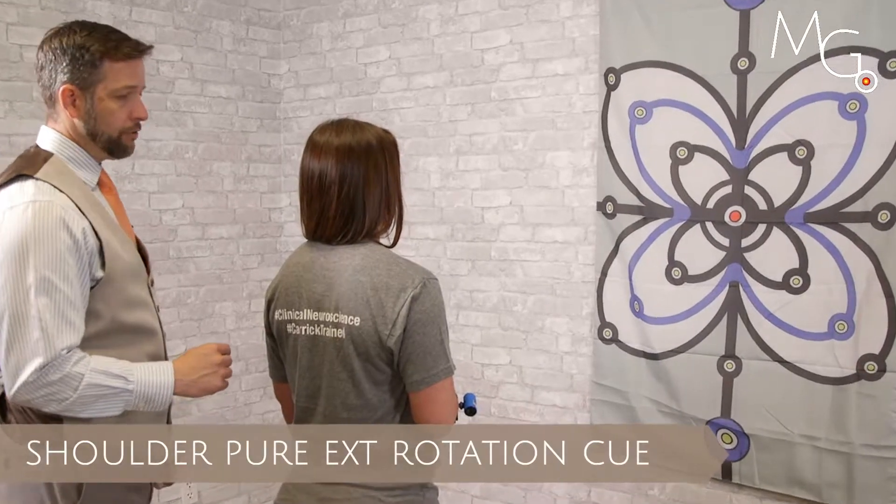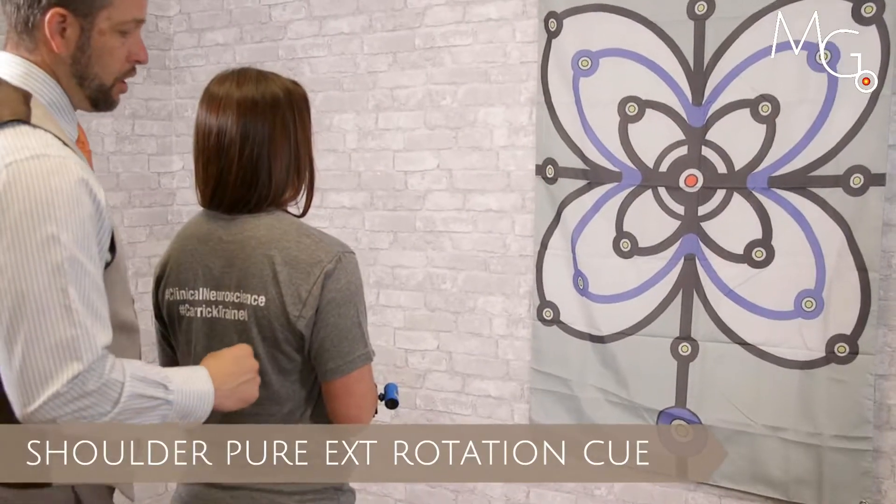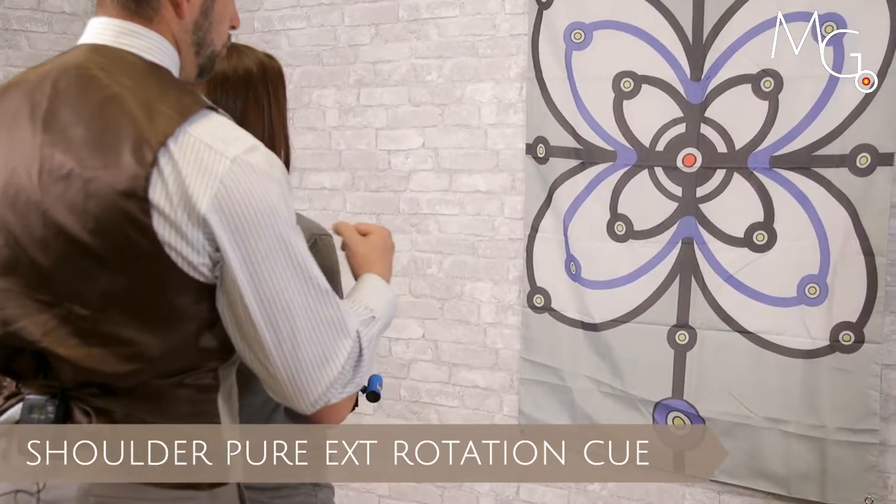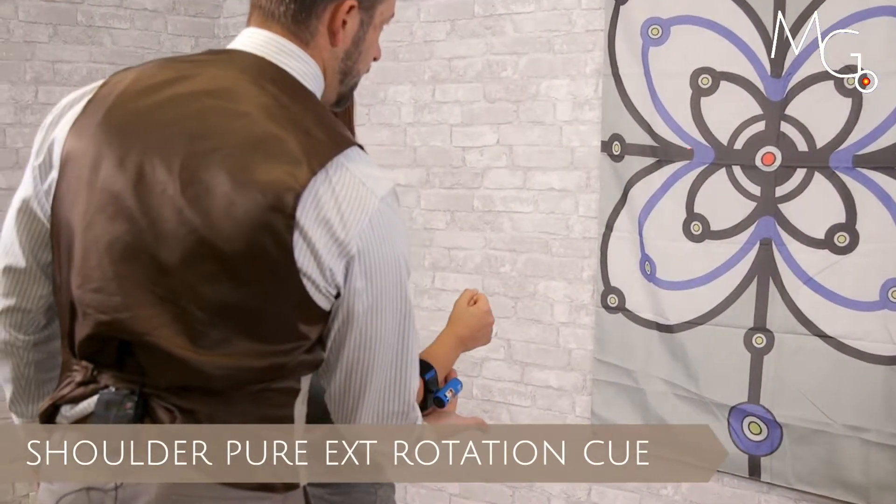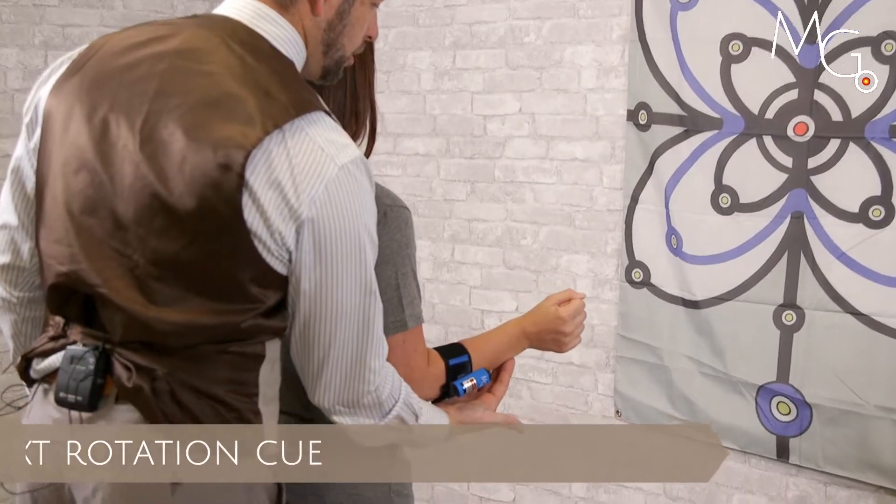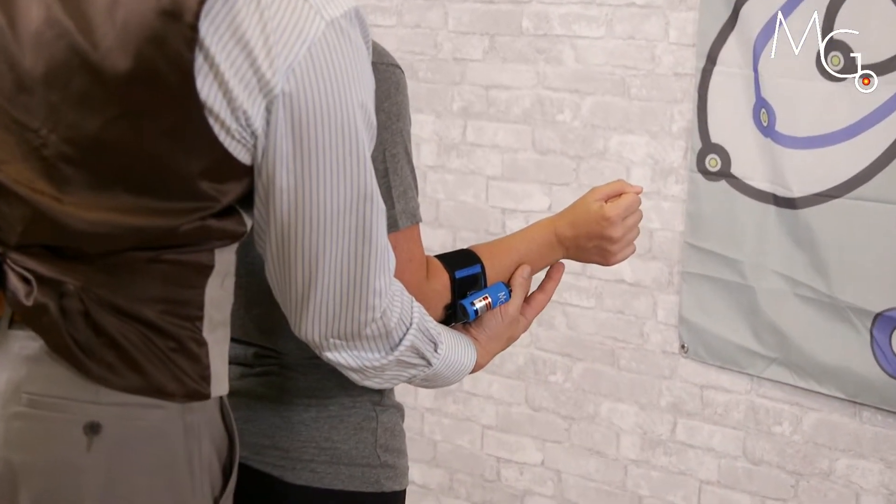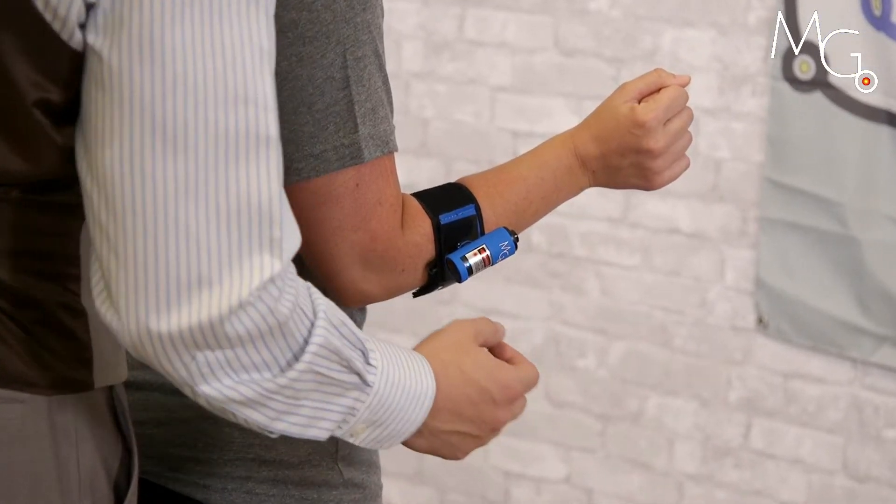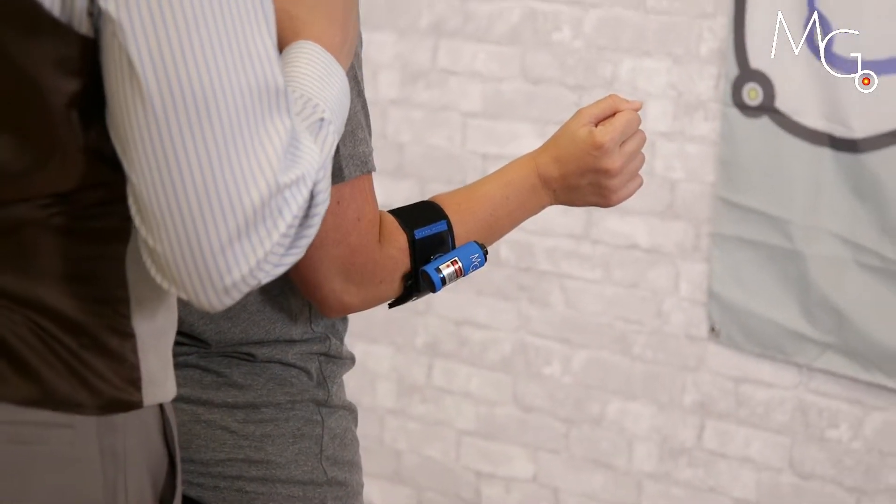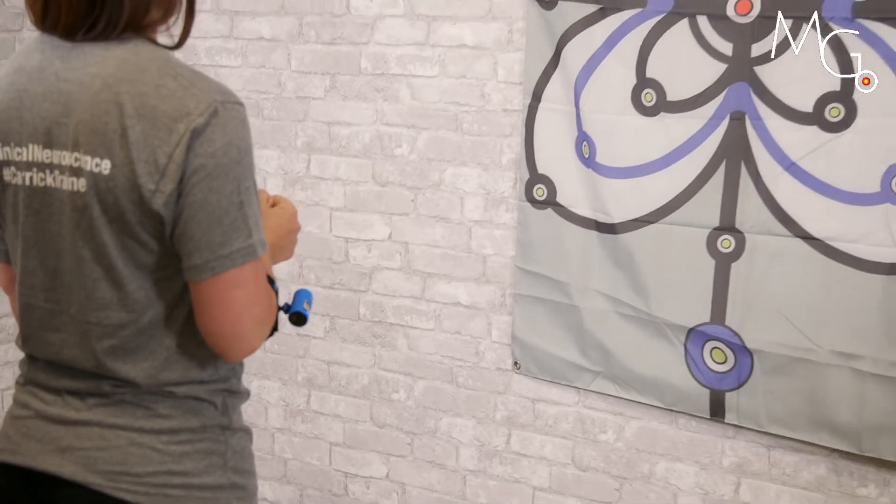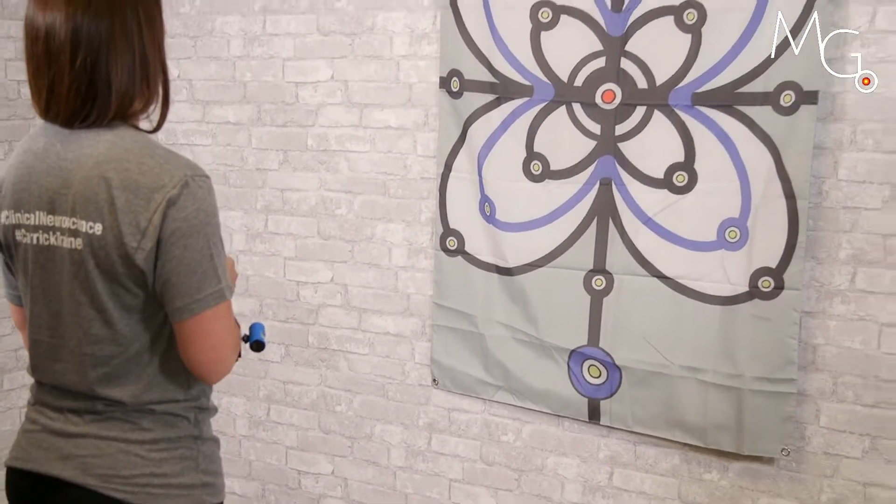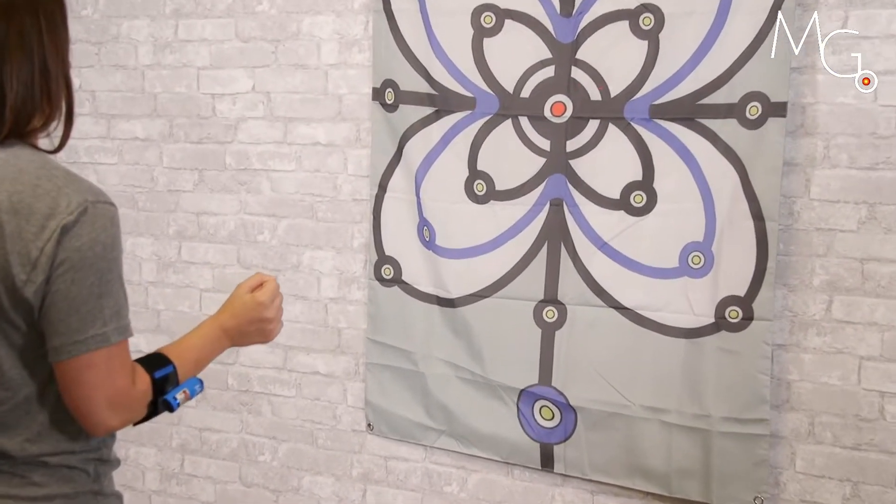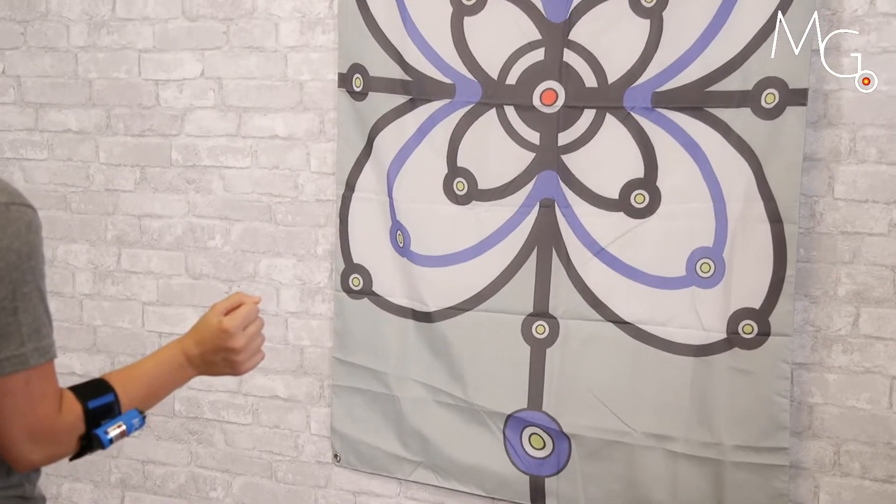For assessing pure external rotation at the shoulder in a fully adducted position, we can have the patient rotate or be positioned into pure external rotation, which is without shoulder extension. So I want that laser to be above a horizontal line, and then have them return and recreate that pure external rotation by staying at or above the horizontal line on the target.